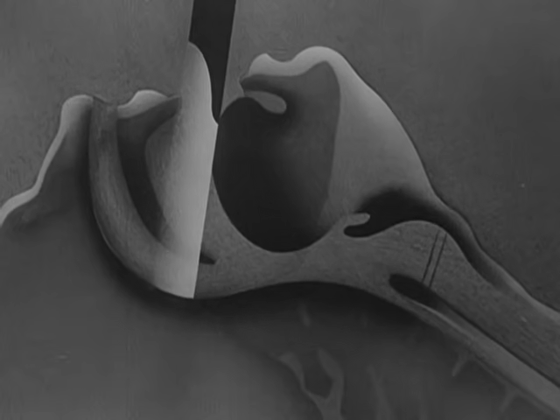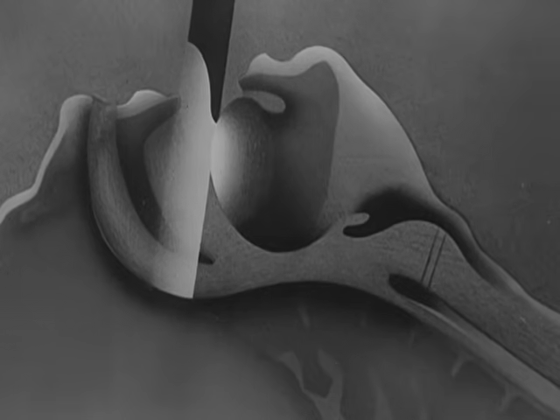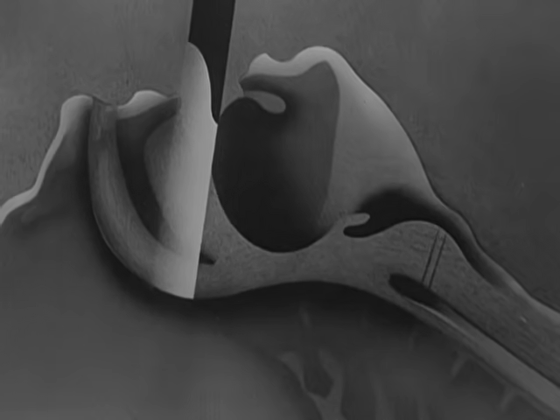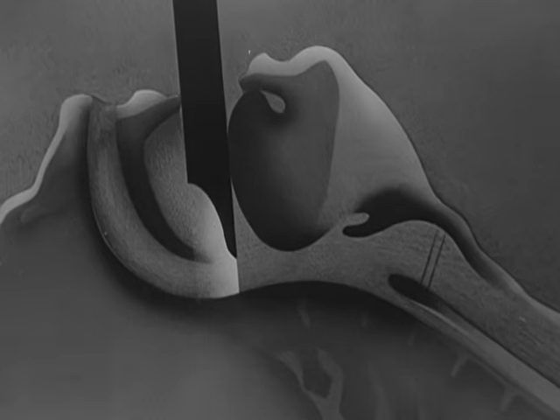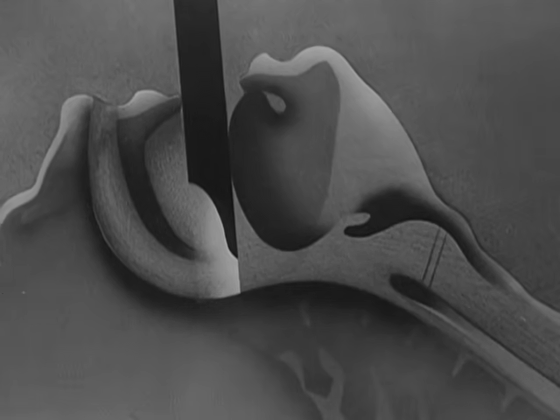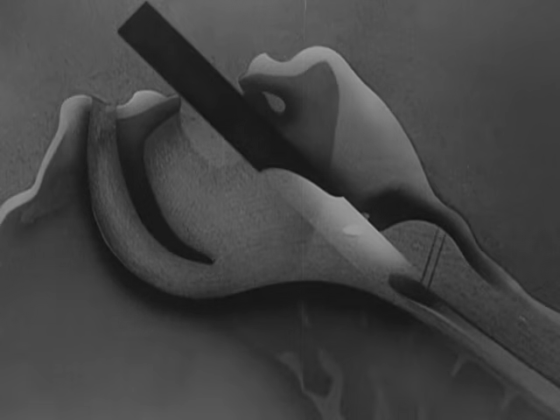First, let us see in this diagram which are the landmarks along the course of the laryngoscope. The first thing to be illuminated is the dorsum of the tongue. The laryngoscope is advanced along the tongue, and when it is advanced about half the distance it must eventually travel, the uvula comes into view. When it has reached 2/3 of the full distance, the epiglottis is seen.